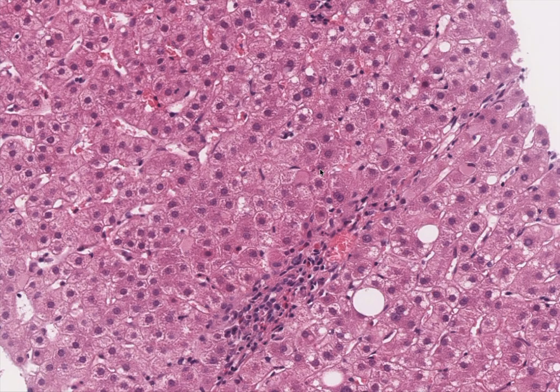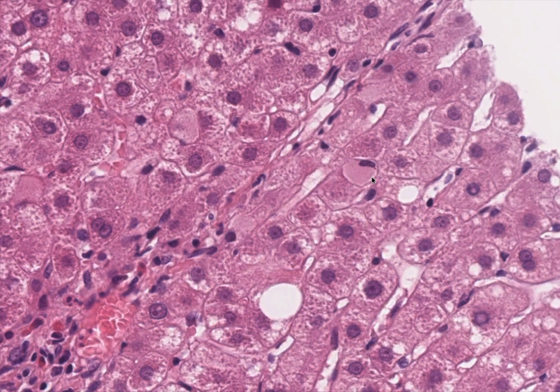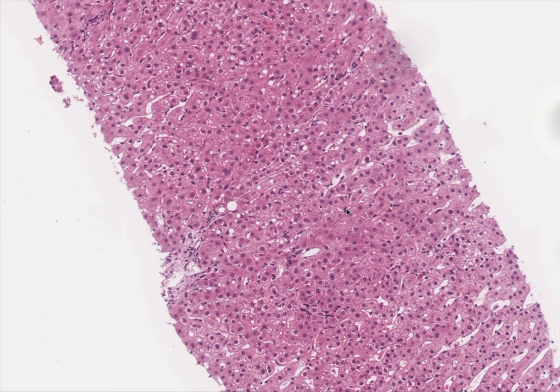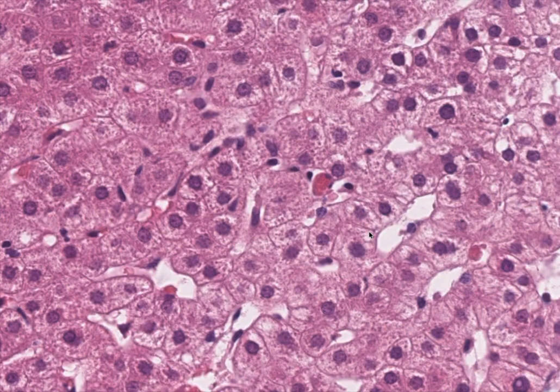One thing I have just noticed right here is that maybe this is a hepatitis B inclusion, and I can see another one here. So this would be a very typical appearance for hepatitis B. Also here, I can see an eosinophil, which is a bit unusual.